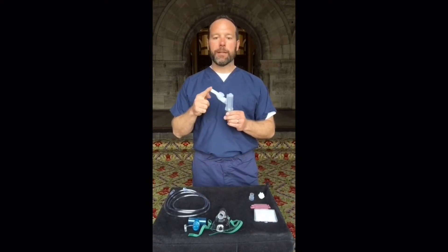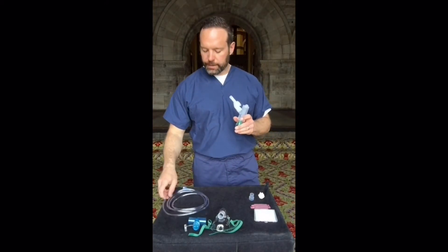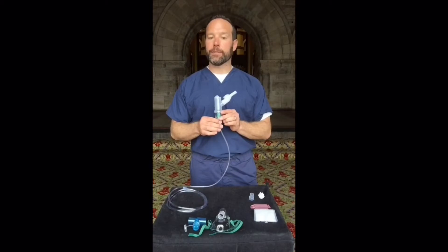When assembling the Nebutek, place the mouthpiece into the side port with both valves facing upright. Then attach the supply tubing to the base of the Nebutek. When you turn the Nebutek on, you will run it at 8 liters per minute.